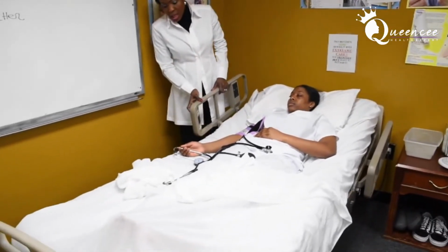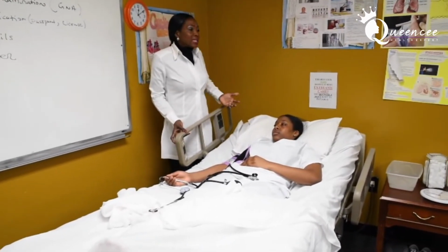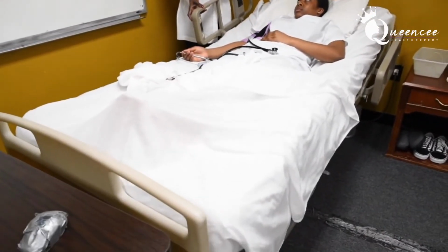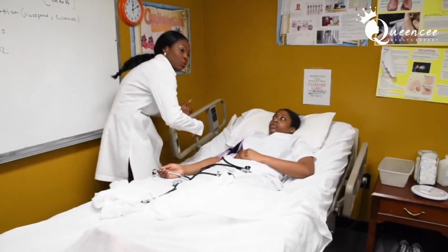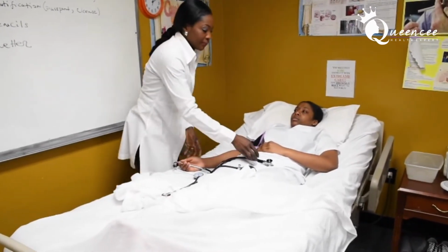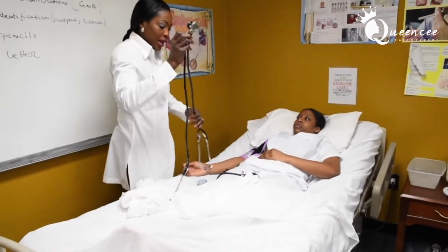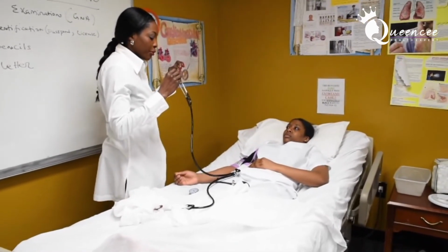So if you think, oh, my back is going to hurt, or I'll be putting too much stress on my back, then by all means you can bring the bed to a comfortable level for you, so you're not all the way down. But if you do that, then when you finish, you have to return to the lowest position for real.